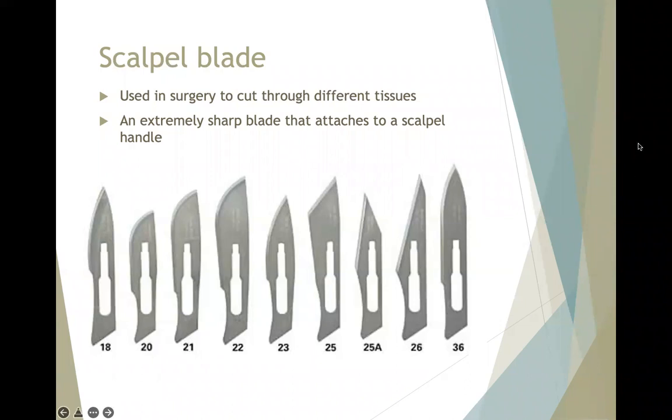Awesome. Yes, so our blades are considered to be sharps, of course, extremely sharp surgical blades. So we will be disposing of these in the sharps container. We do not throw these away in the regular trash. They have to go in sharps, or we also call it biohazard or bio waste bins. Some hospitals will have certain bins that are specifically for biohazard waste, like blood or samples, versus ones that are specifically for sharps. But yes, both biohazard and sharps container are the correct answer. So good job, you guys.